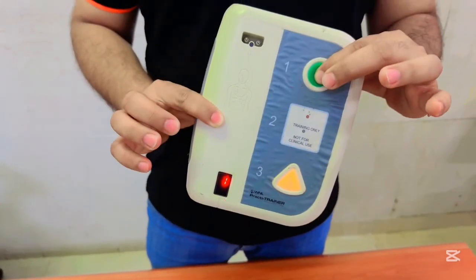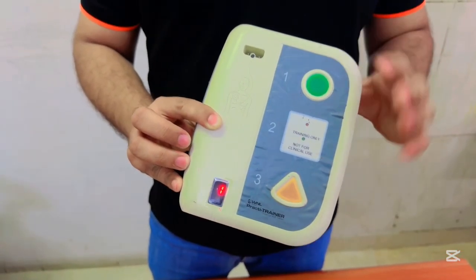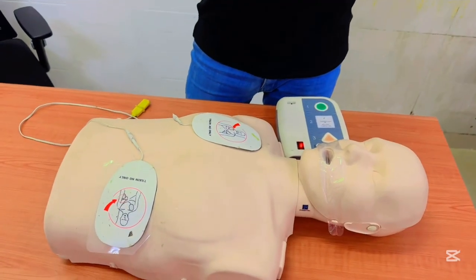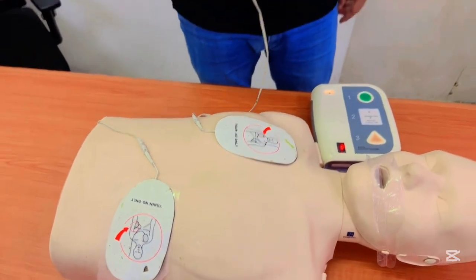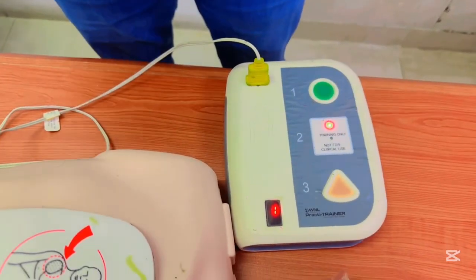Now we simply have to turn on the device. Apply pads to patient's bare chest. Plug in pads connector next to flashing light. AED will provide you all the instructions. We simply have to follow the instructions. Pads, plug in connector. Analyzing heart rhythm.